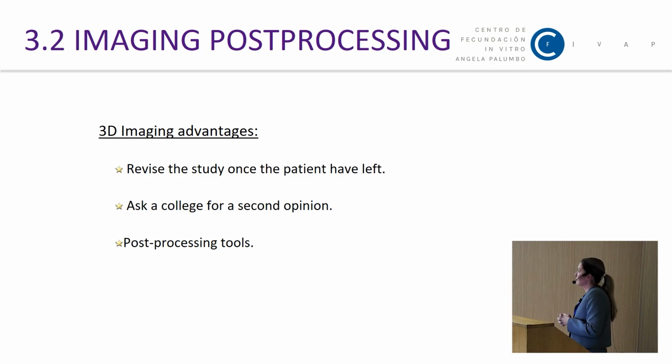3D imaging has several advantages that are widely known and demonstrated. It gives you the opportunity to revise the study when the patient has left. You can ask a colleague for a second opinion without disturbing the patient. And you can use the post-processing tools to enhance your findings or to aid in the diagnosis.